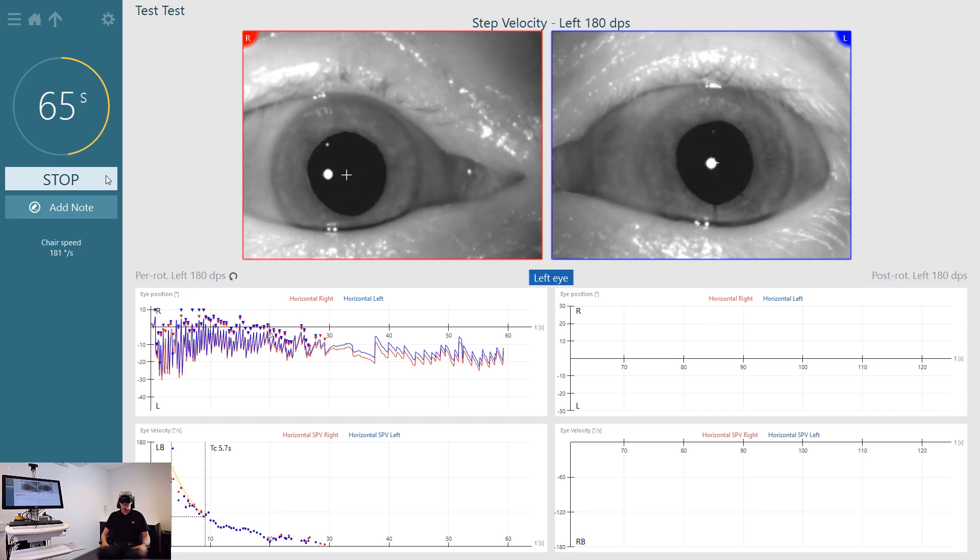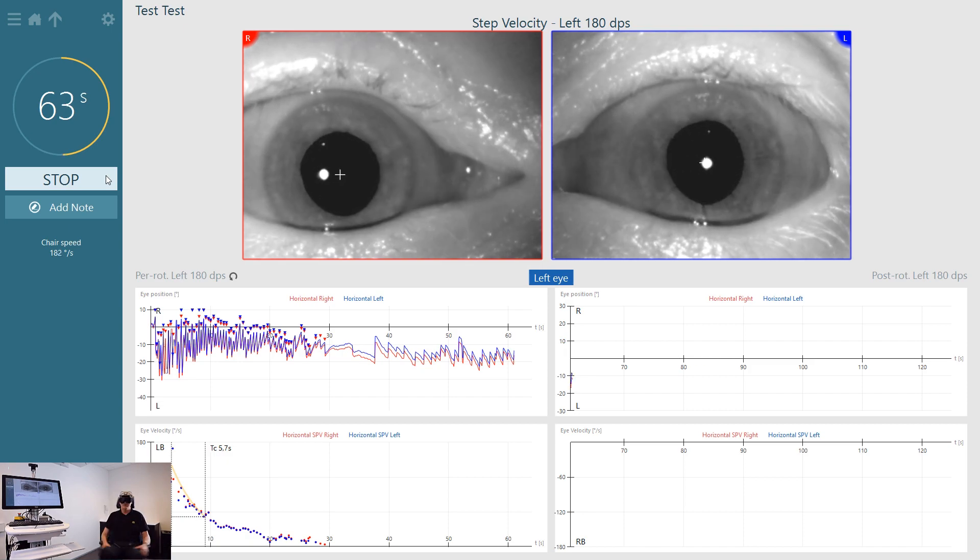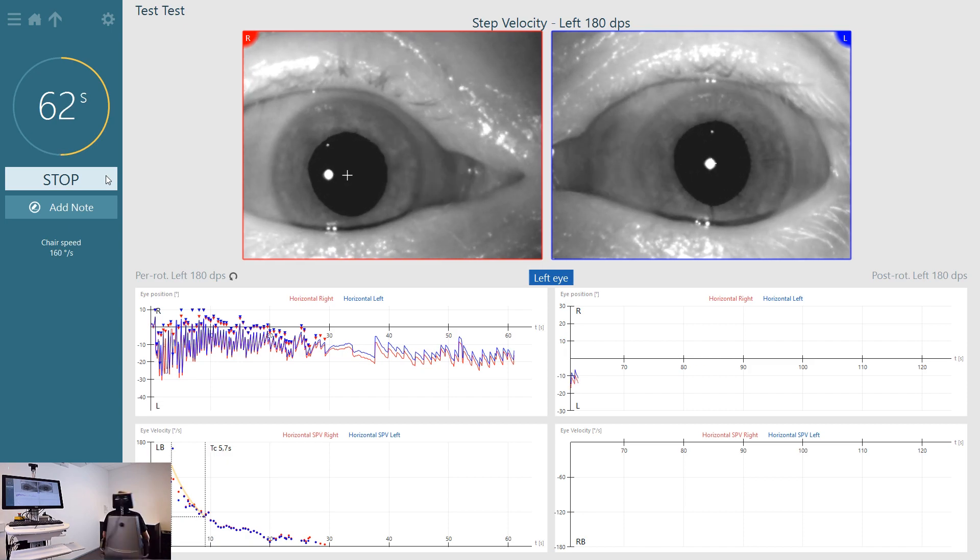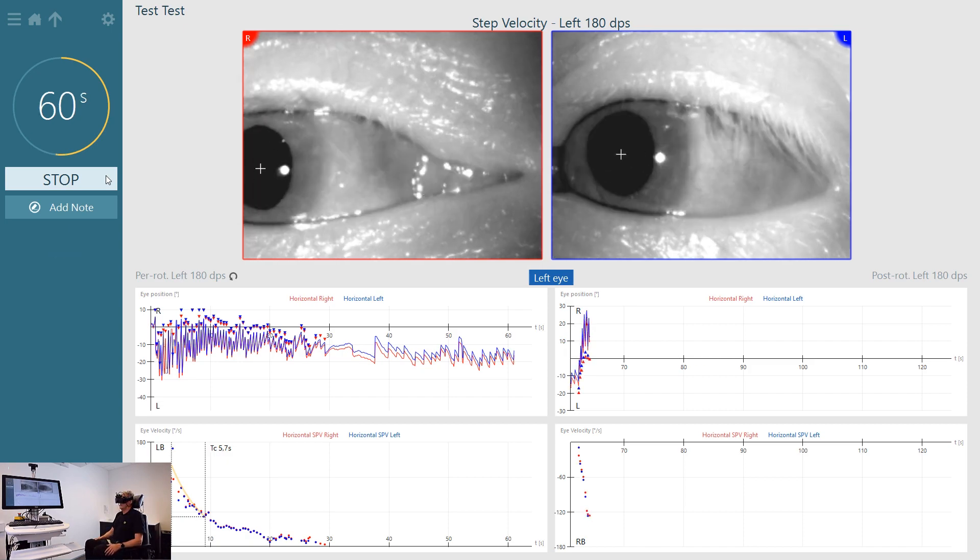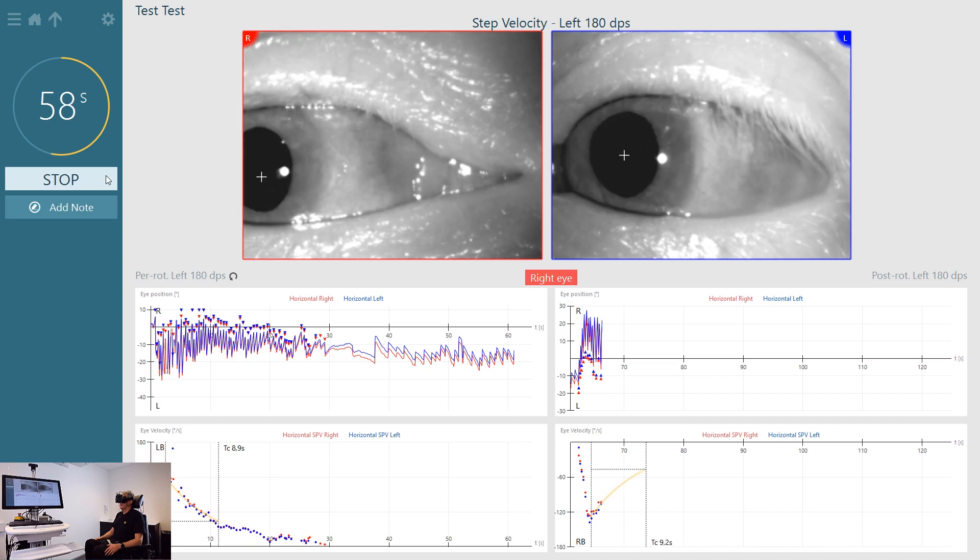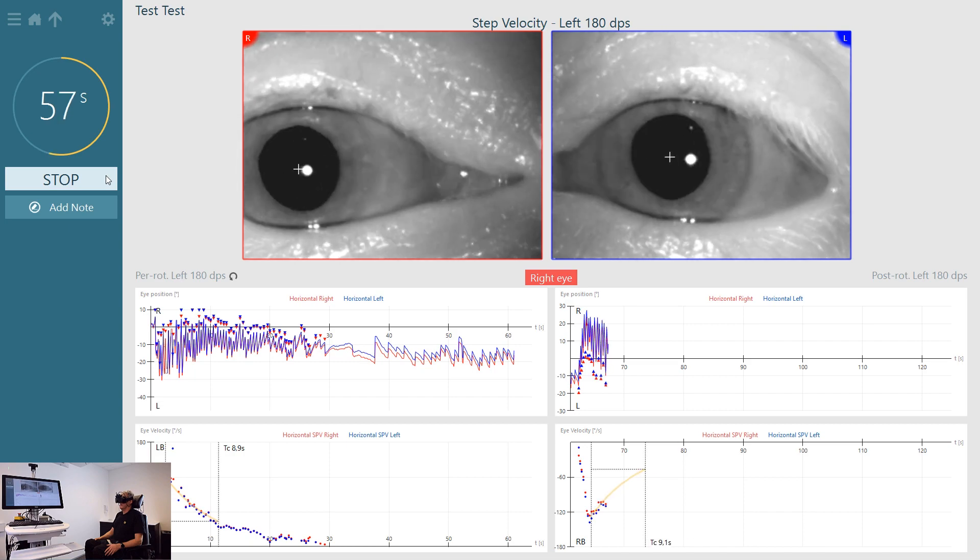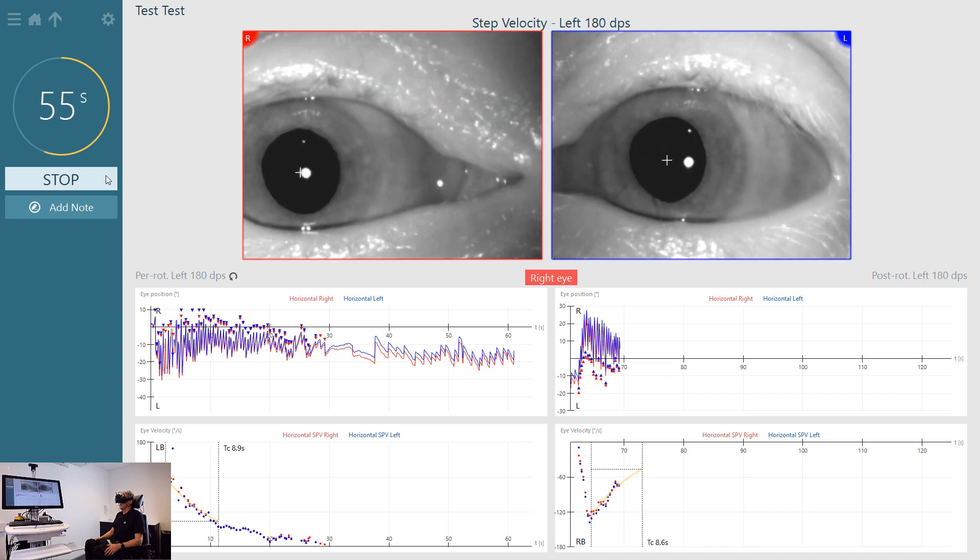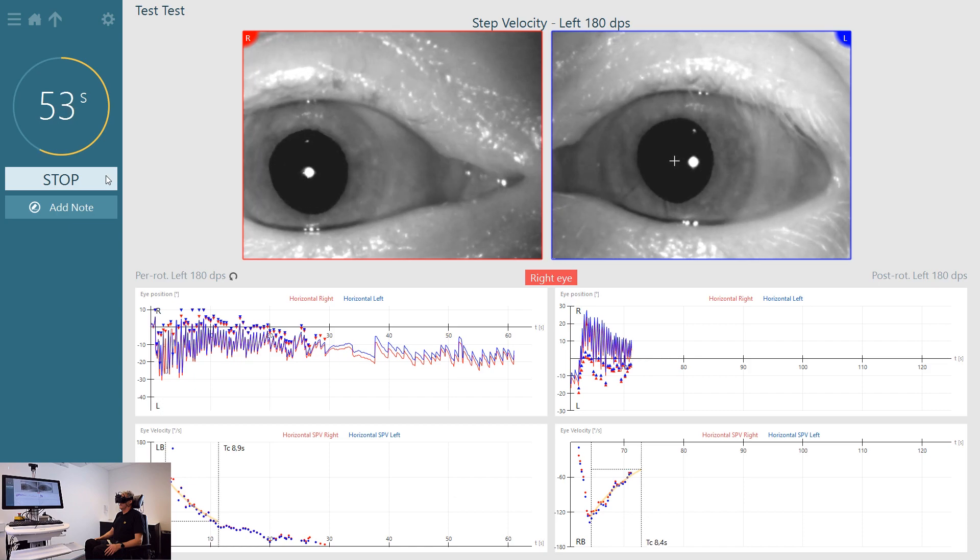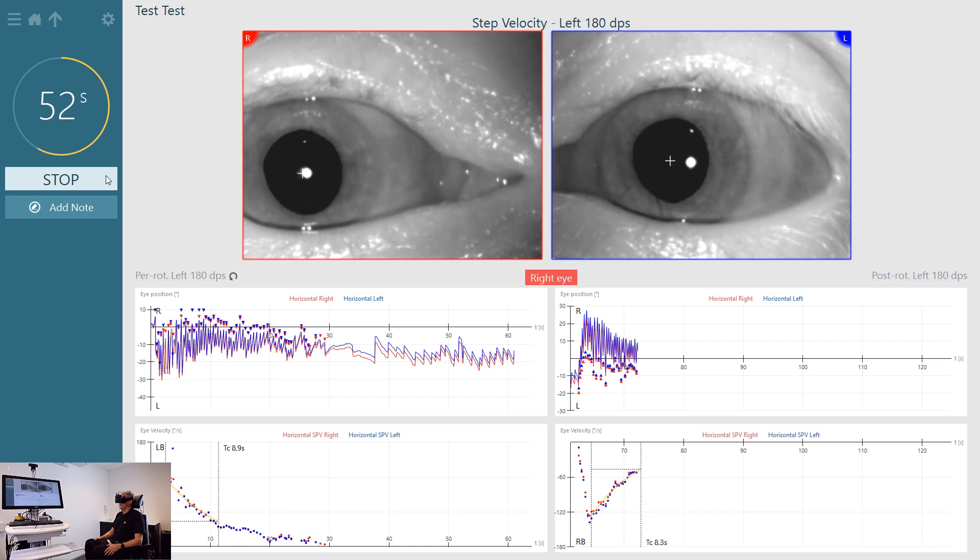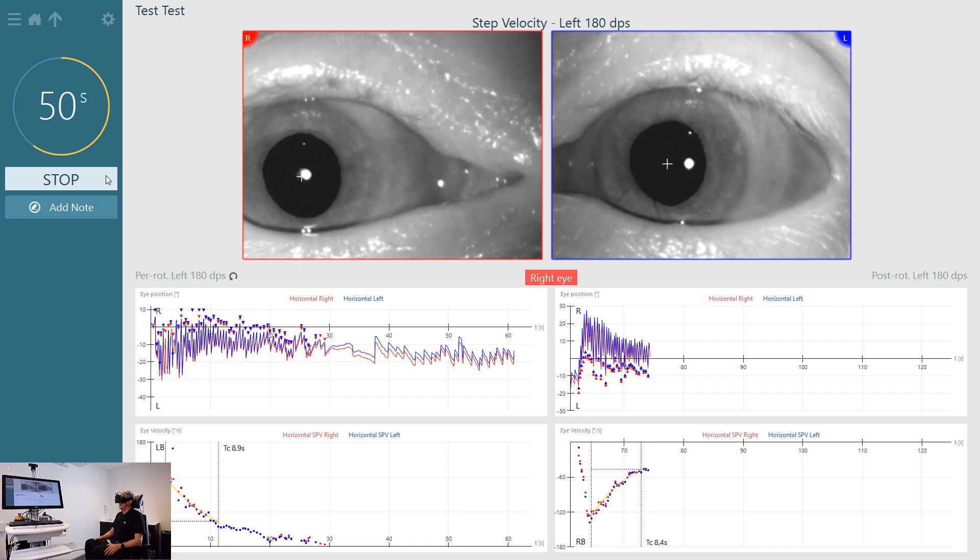Having accelerated the patient to a much higher speed, when the patient now comes to rest you can see the slow phase velocity that's generated peaks at a much higher velocity than in the slower velocity test.